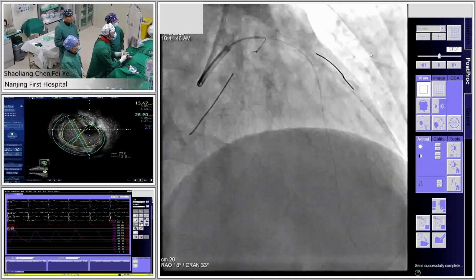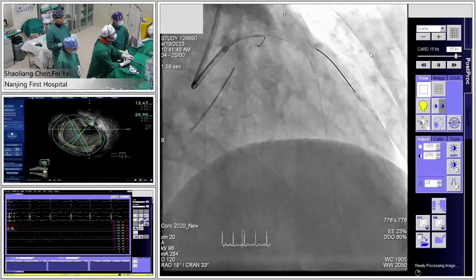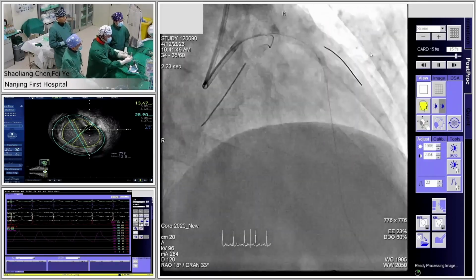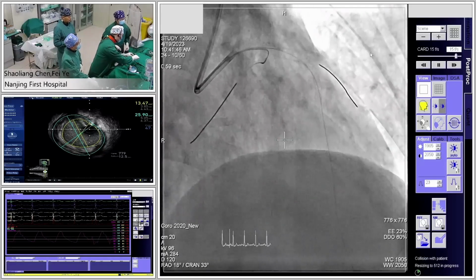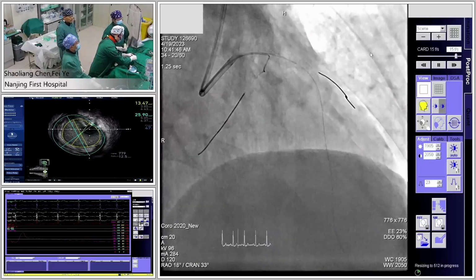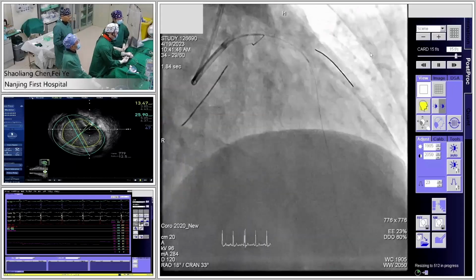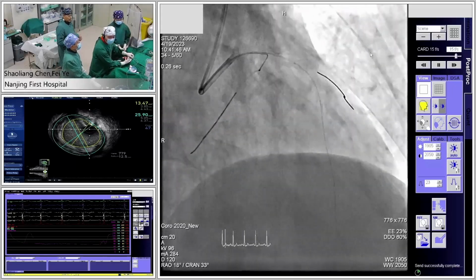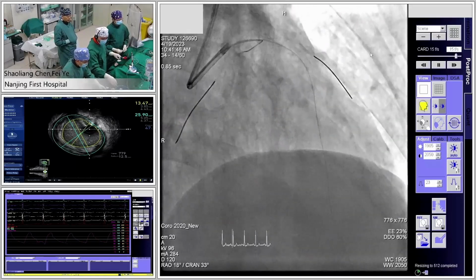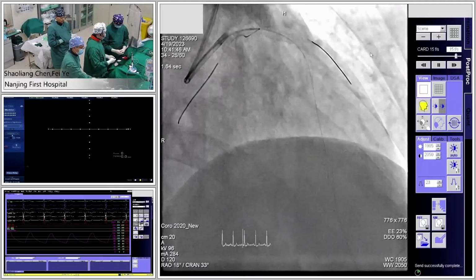Okay. Good. It's better. So I think now you can check the IVUS. Nitro, please. Angiographically, it looks like the proximal LAD stent was fully expanded. Much better. And also TIMI flow in the circumflex is TIMI 3. Very good result. So far, the patient did not have any sign of chest pain, and the screen did not show any ischemic change on EKG. This is a great case.